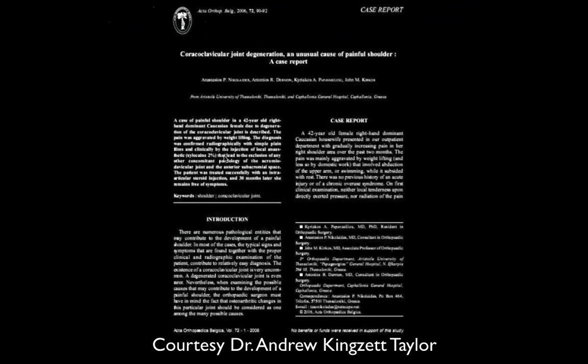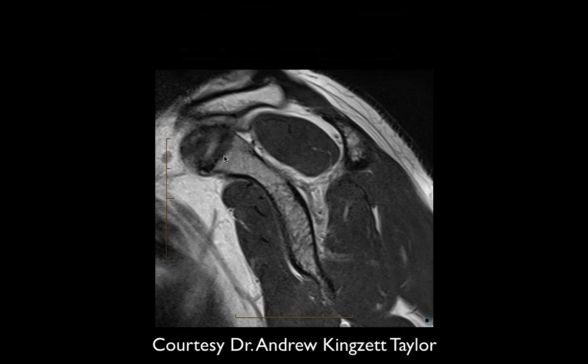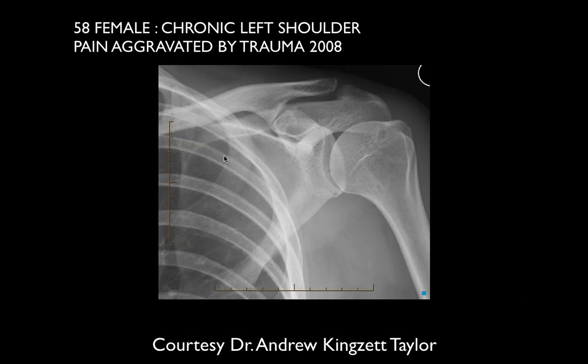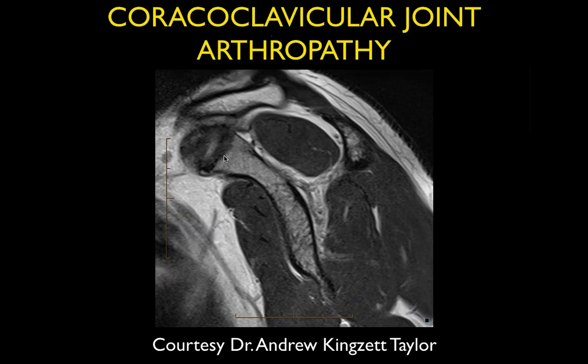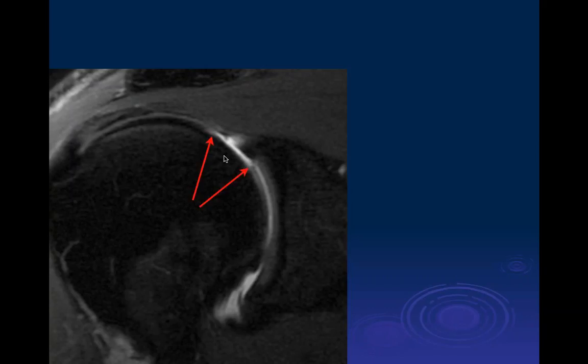By 2010 with worsening chronic shoulder pain, this shows hypertrophic inflammation with a pseudo-arthrosis and significant degenerative disease at the pseudo-arthrosis. Whether this is post-traumatic or congenital is debated — without pre-accident imaging it's impossible to confirm.